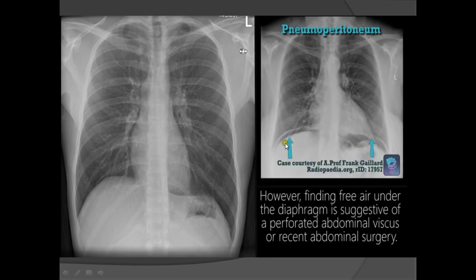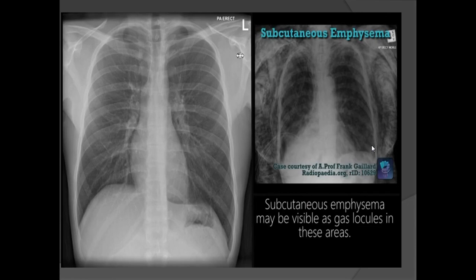In this patient there is free air under both the right and left hemidiaphragms — this is pneumoperitoneum, which is an acute emergency; the patient must be rushed immediately to the surgical department. In another patient there is an excessive amount of air within the soft tissue planes.